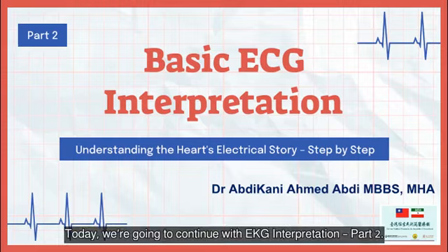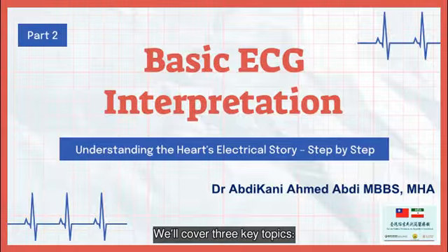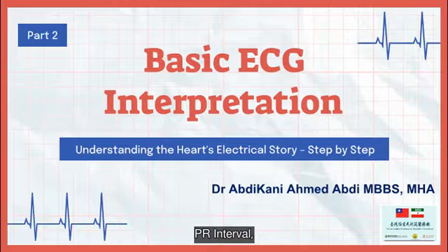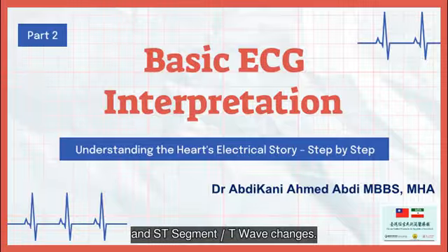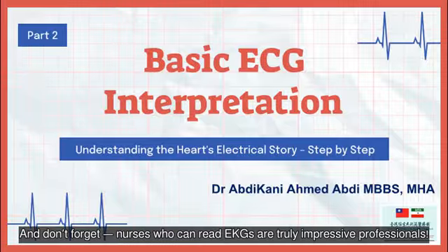Today, we're going to continue with EKG Interpretation, Part 2. We'll cover three key topics: PR interval, QRS Complex Abnormalities, and ST segment/T wave changes. And don't forget, nurses who can read EKGs are truly impressive professionals.